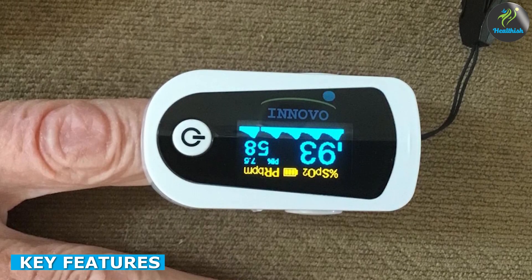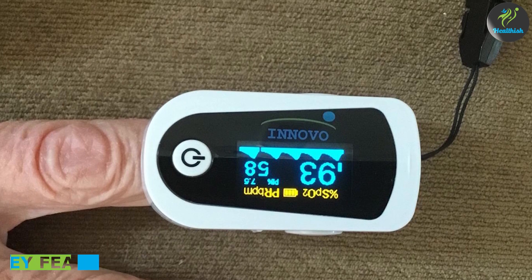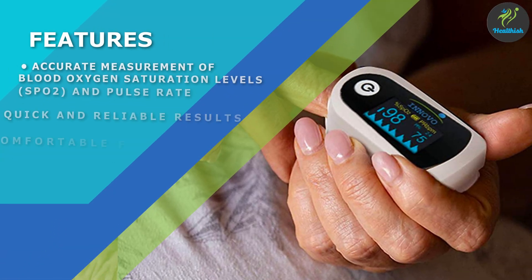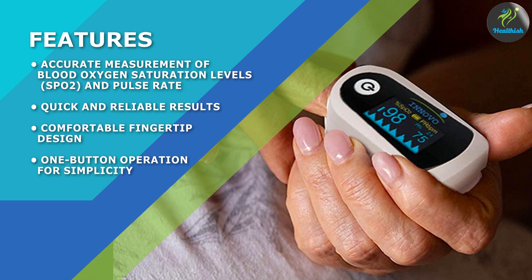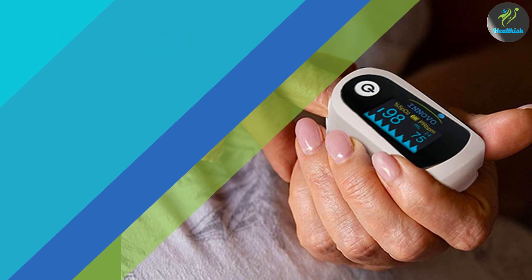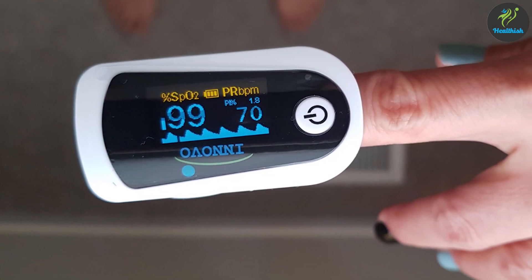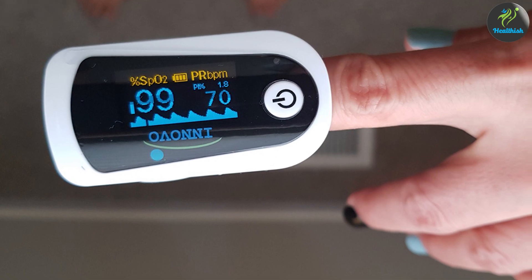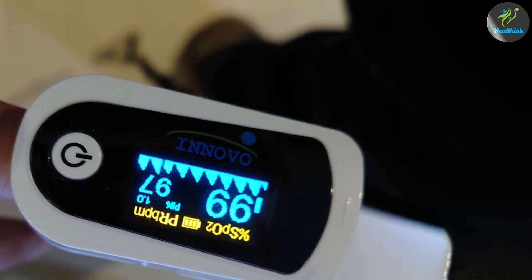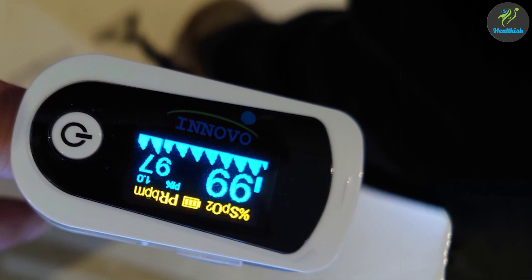Let's delve into the key features of the oximeter. It utilizes advanced technology to quickly and accurately measure your SPO2 levels and pulse rate. The device features a large LED display that shows the readings in an easy-to-read format. Additionally, it has a dual-color display that alerts you to abnormal readings and low battery status. The Innovo IP900BP is also designed with energy efficiency in mind, automatically shutting off after 8 seconds of inactivity.